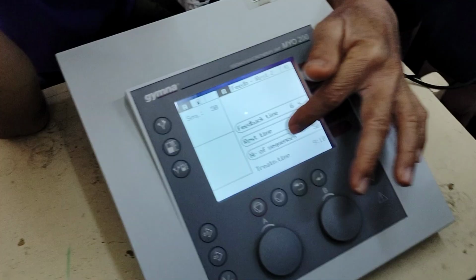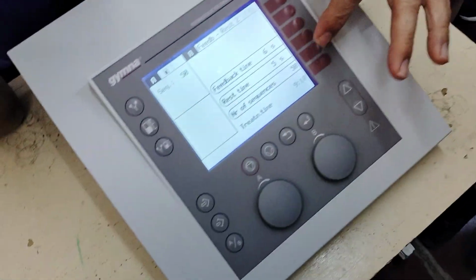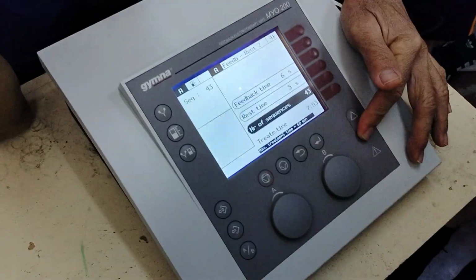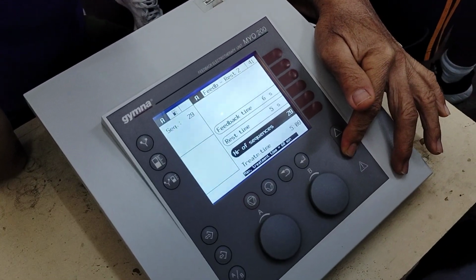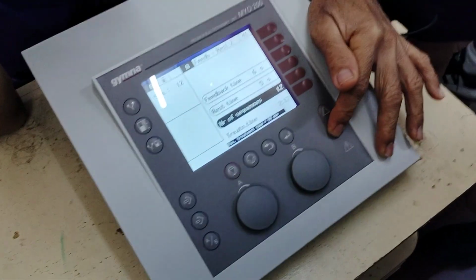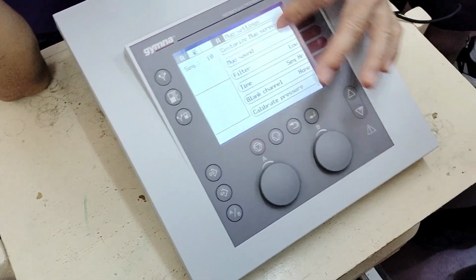The sequence is one cycle: after feedback, after rest, and then how many cycles you want. Let's just say you have 10 cycles, or 10 sequences. If you place that at 10, it's okay. So with regards to this aspect, it's okay.